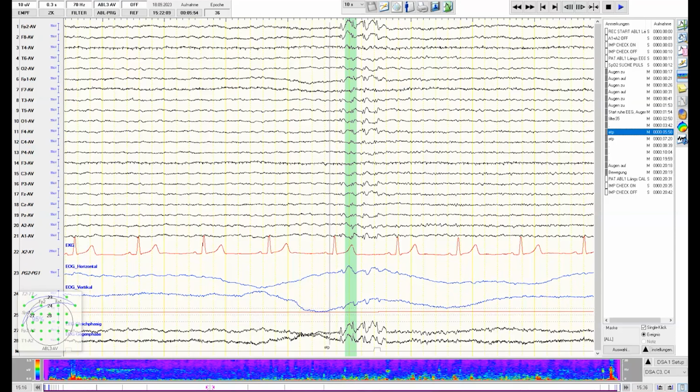Yeah, that's a very, very good question. Due to practical reasons in clinical settings, sometimes you only use one EOG, then it makes a mixture of both. So you have a diagonal recording, which records vertical and horizontal movement at the same time. So you don't have differentiation then. It's not so good for differentiation, but however, you can use a trick.